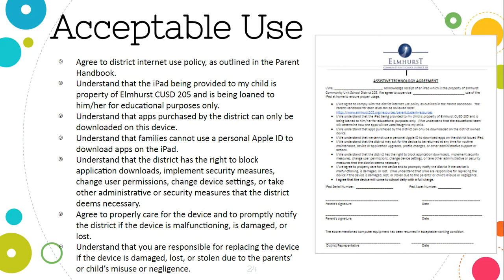So just making sure that you're using the device appropriately, and thinking like, okay, if I was making the payments on this, or if I was paying for it myself, would I take it to this place? So just thinking that through. And again, if your child goes somewhere consistently, like the pool or things like that, that you need some additional support for, please reach out.